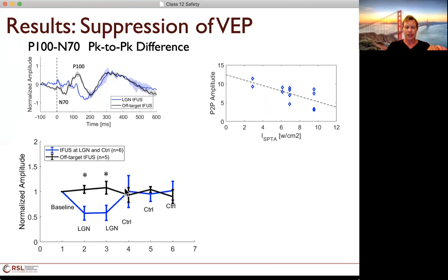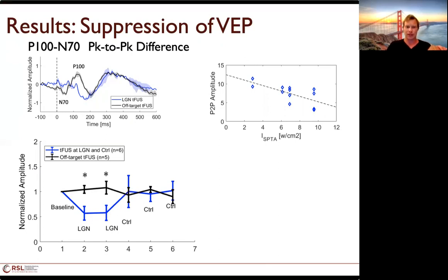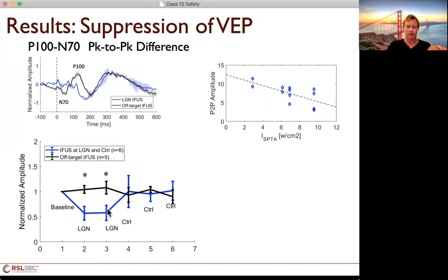As you can see there. Each one of those data points is 20 minutes apart, essentially? Yeah. Okay. So we didn't have great temporal sampling because the temporal sampling was 20 minutes. But that is a limitation. So, whether or not this might have shown that there was a period before it came straight back is just not something that this data was telling us because of our temporal sampling.